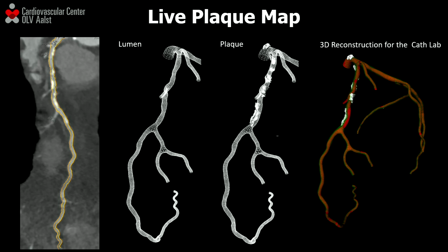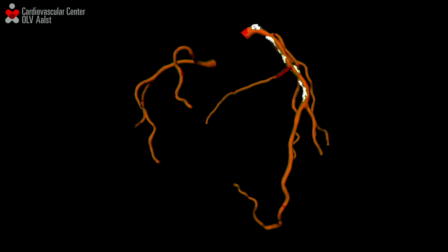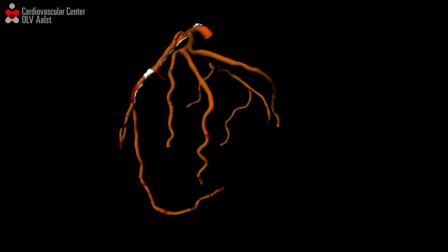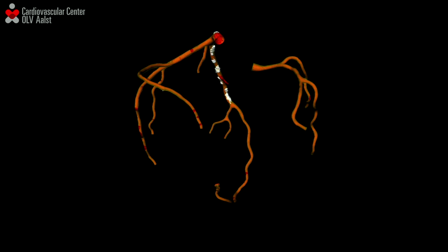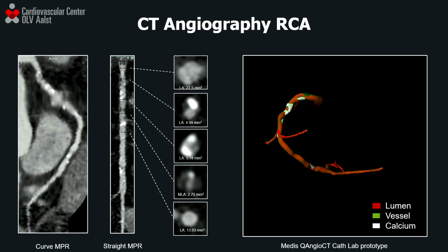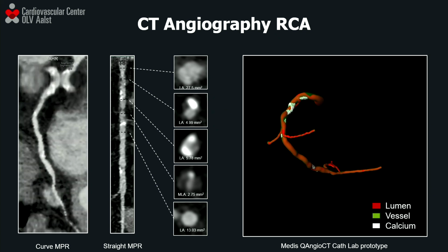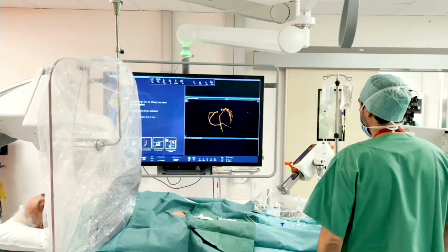model. And you see here that the interpretation is very quick, and it will take you 10 seconds to understand that the white is calcium, that the red is the blood, and you see all this non-calcific plaque in green. And why is this important? Because we see this live, and this is, in my view, the first time that we can assess coronary artery disease in 3 dimensions. And for us, it's important. Why? I'm going to show you how we finally use these images.